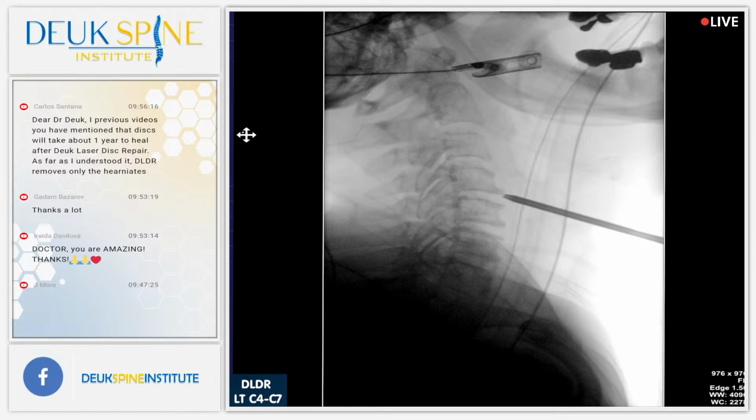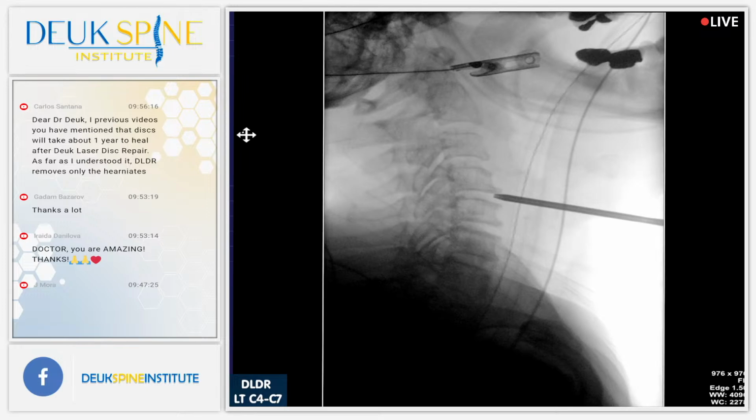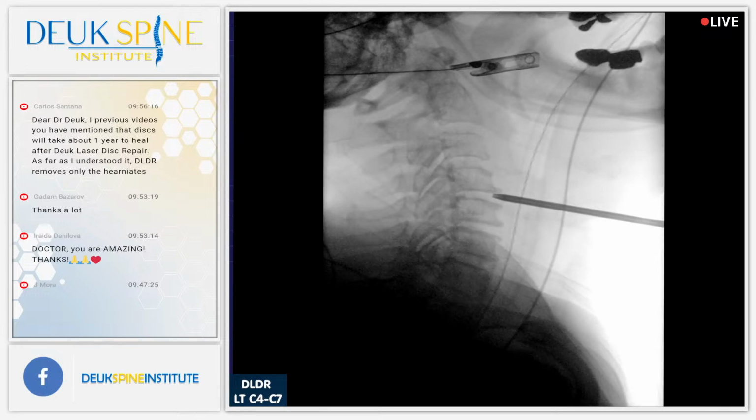We're going to enter through the anterior annulus, shot. I'm just gently tapping in, shot. And as I enter this annulus in the front, I want to verify that I'm not sliding to the side. Take AP, 2, 3, 4, 5. You want to make sure that you're not sliding because the front of the disc can be slippery.